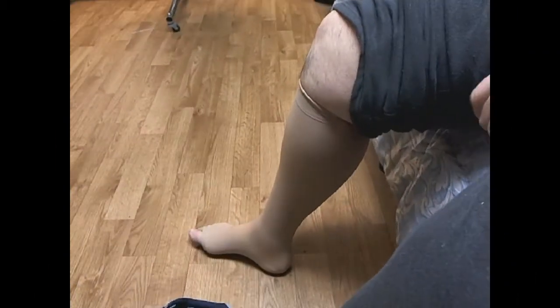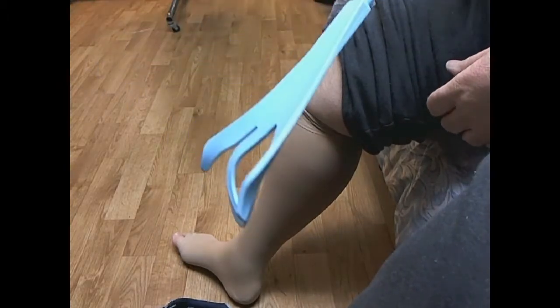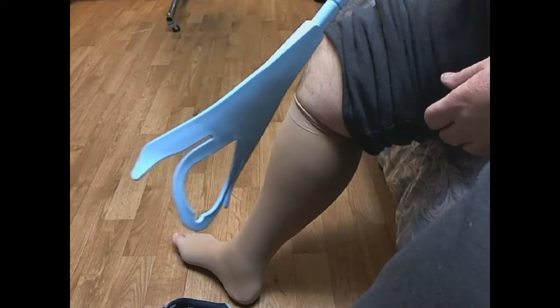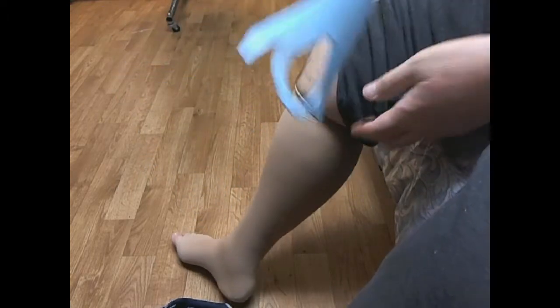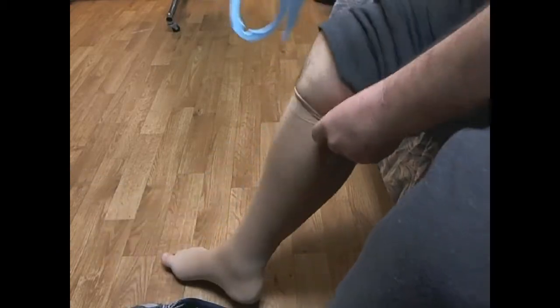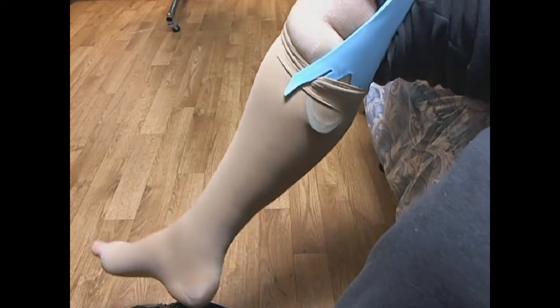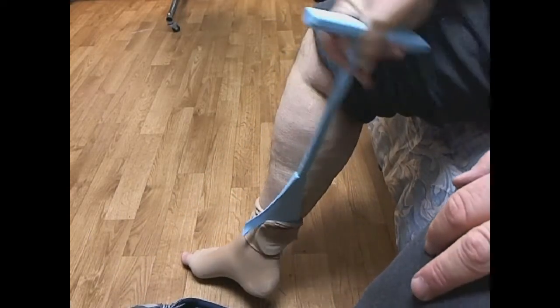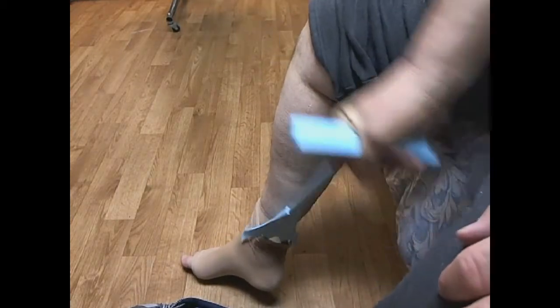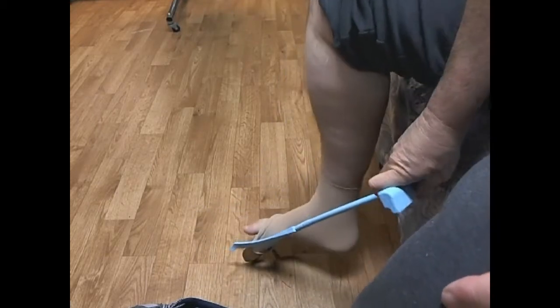All right, let's. Oh, I forgot to tell you how to get the socks off. Again, this is part of that easy on, easy off sock aid, and that's what this thing is for. You can use it on these socks or any other socks. You take it and you put it right behind the sock and you push. This way you don't have to bend over. You don't have to break that 90-degree rule, and just take them right off.